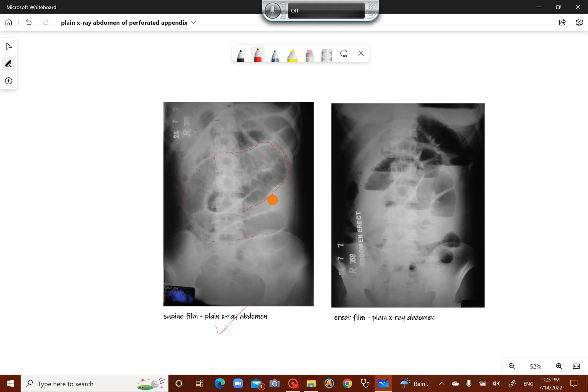And in the erect film, this is the erect film of the same patient. You see multiple fluid levels here and here — these are multiple fluid levels suggesting intestinal obstruction.